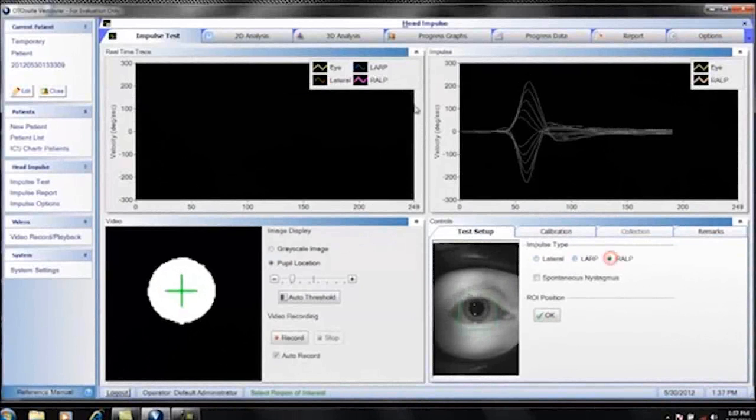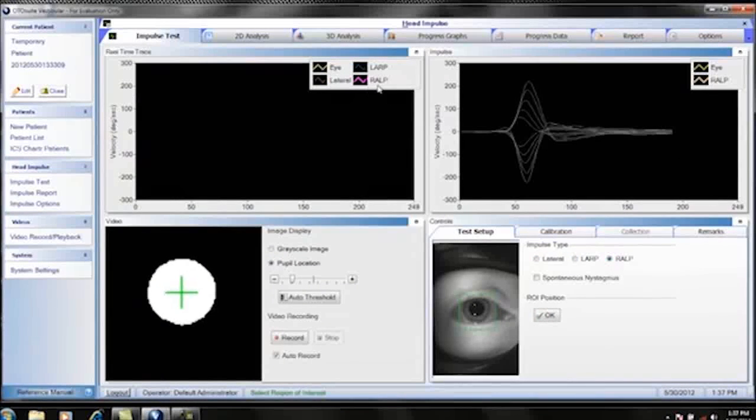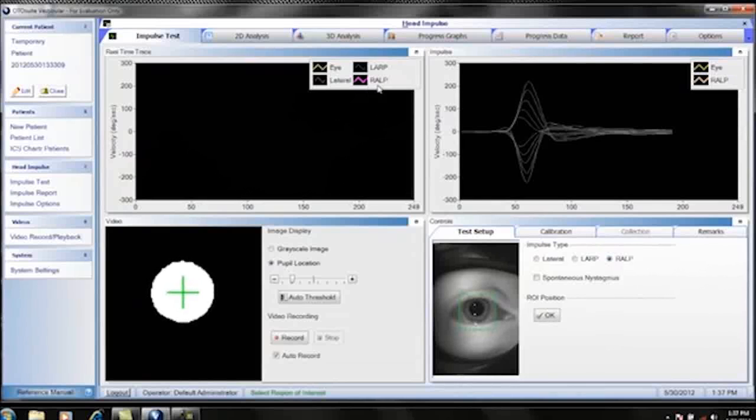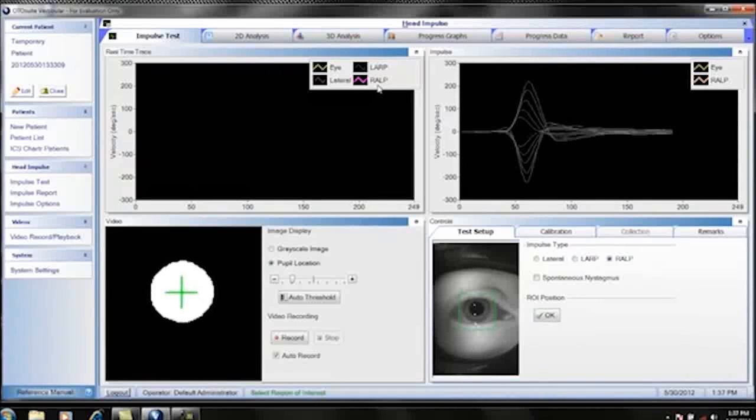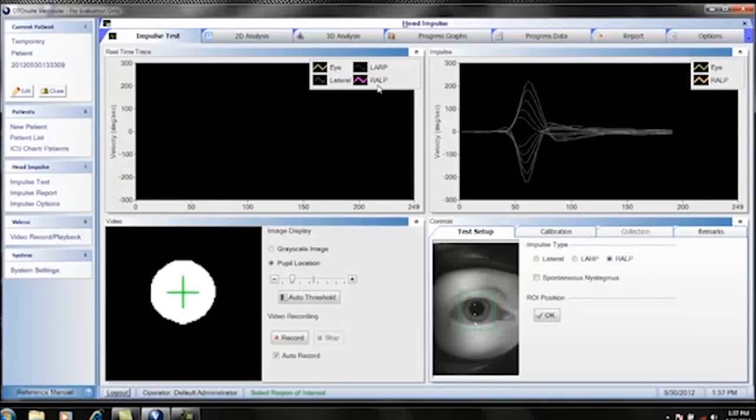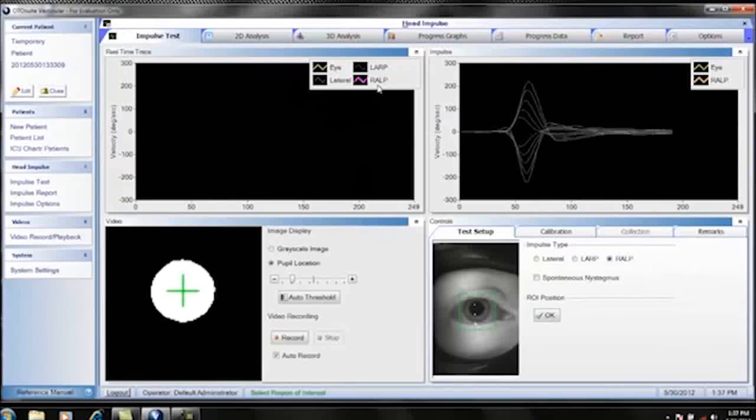This is because you're determining which plane of the gyroscopes you're recording from. So lateral would be a horizontal plane, LARP would be running from left anterior to right posterior, and RALP would be running a plane from right anterior to left posterior.